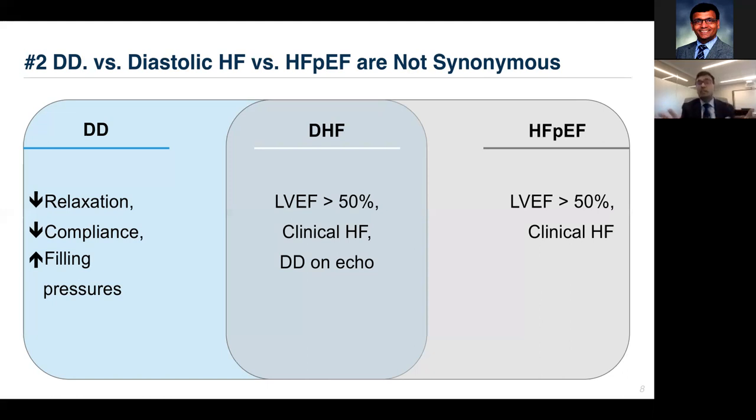So these concepts currently are not very coherently described in the literature, and different phenotypes are described. But it is important to understand that in heart failure with preserved ejection fraction, many patients may not have all the criteria suggesting the presence of diastolic dysfunction, versus some people have more profound features that suggest cardiac factors are involved as a mechanism of heart failure with preserved ejection fraction.